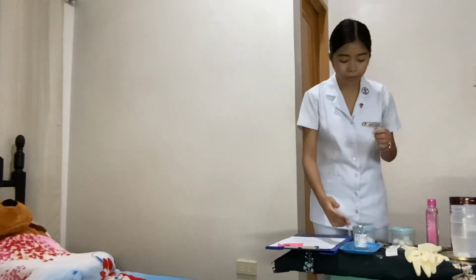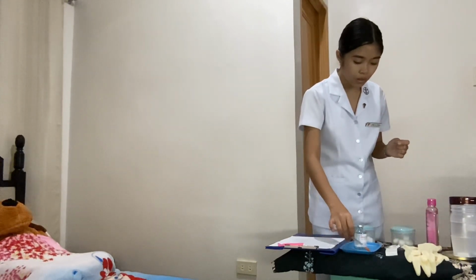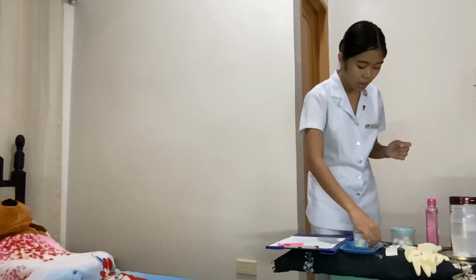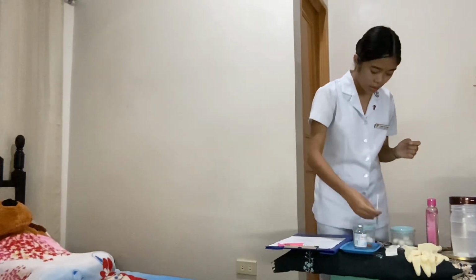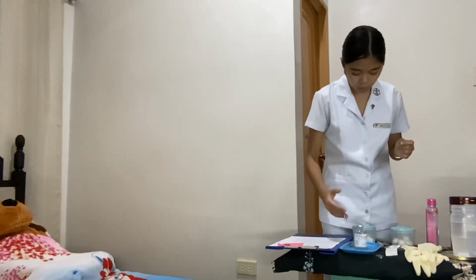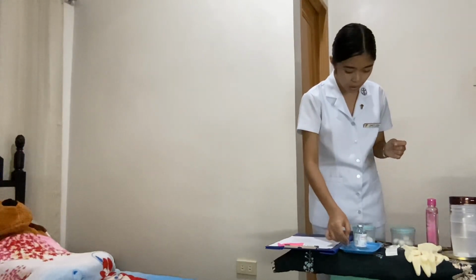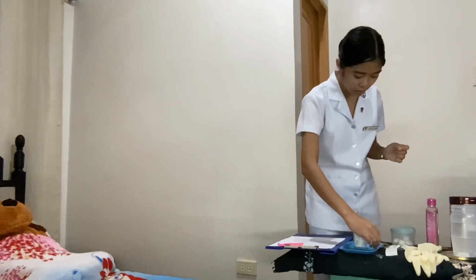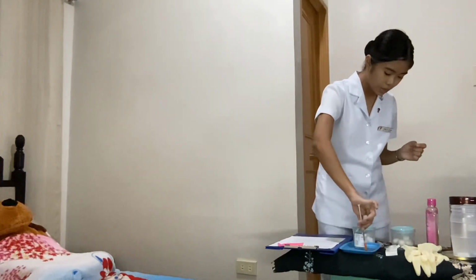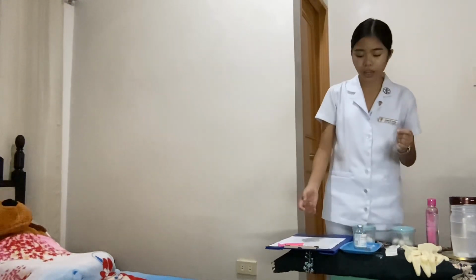And also remember to never recap the syringe, for us and also for you, to prevent any needle prick injury. So what you're going to do is the fish hook method, where you close the cap of the insulin syringe like this. After you have prepared the medication in the insulin syringe, you're going to put that in our medication tray.